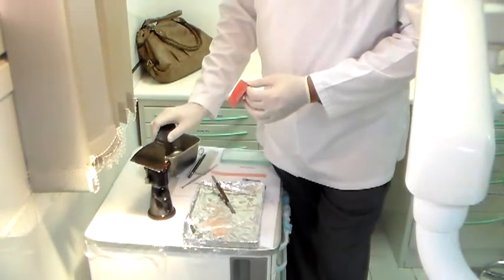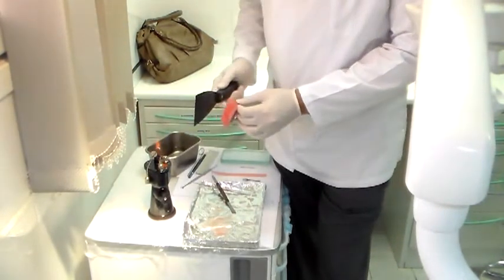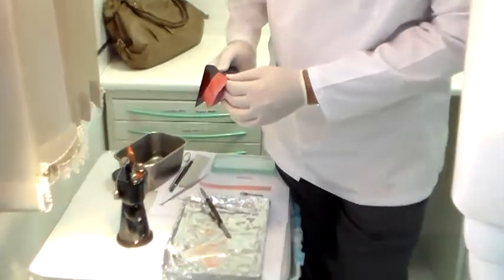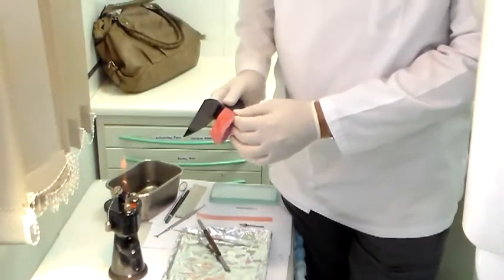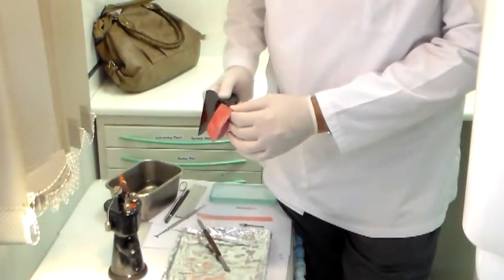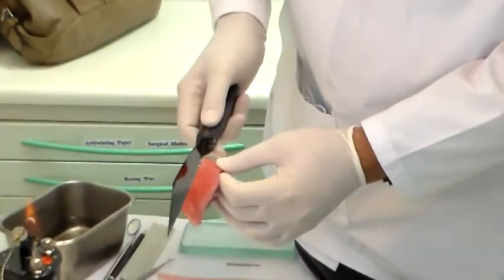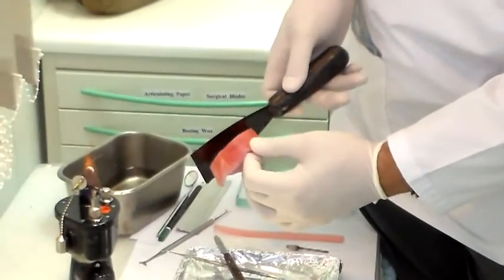When you want to reduce the posterior part, heat up your instrument nicely. You want to touch the posterior until it comes to the level of the anterior. The anterior we have already adjusted to the lip visibility, so you don't want to reduce that. Touch here, and you want to touch both parts — not just one, but both.